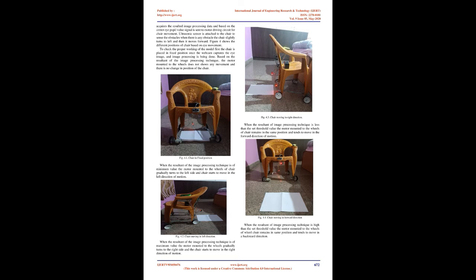Results acquired by the system are based on the image processing, value of eye pupil center and value of signal is sent to motor driving circuit for motion of wheelchair. Ultrasonic sensor used for detection of obstacle successfully measures the distance between the obstacle and the wheelchair. Whenever the object is very near to the wheelchair, object is detected, and whenever it crosses the minimum threshold distance value, brake is applied to shut down the movement of the wheelchair.